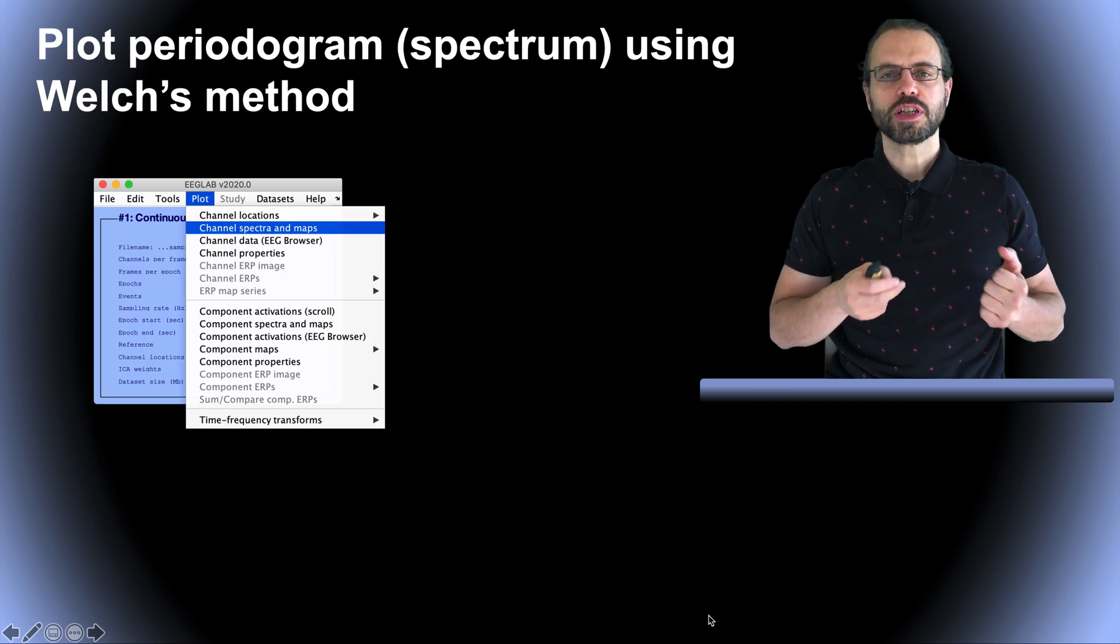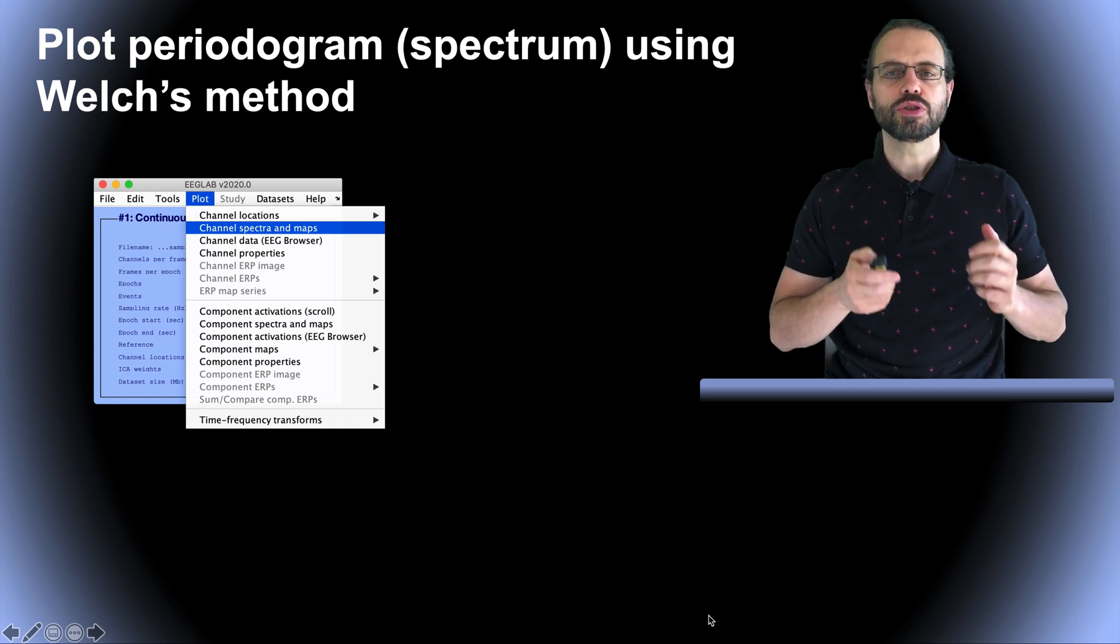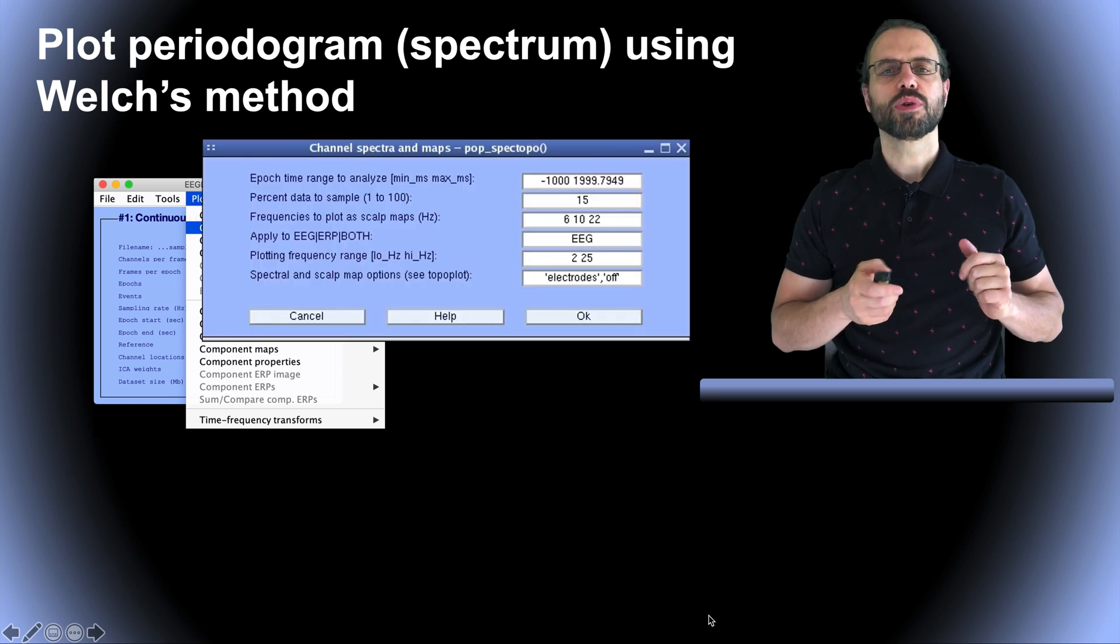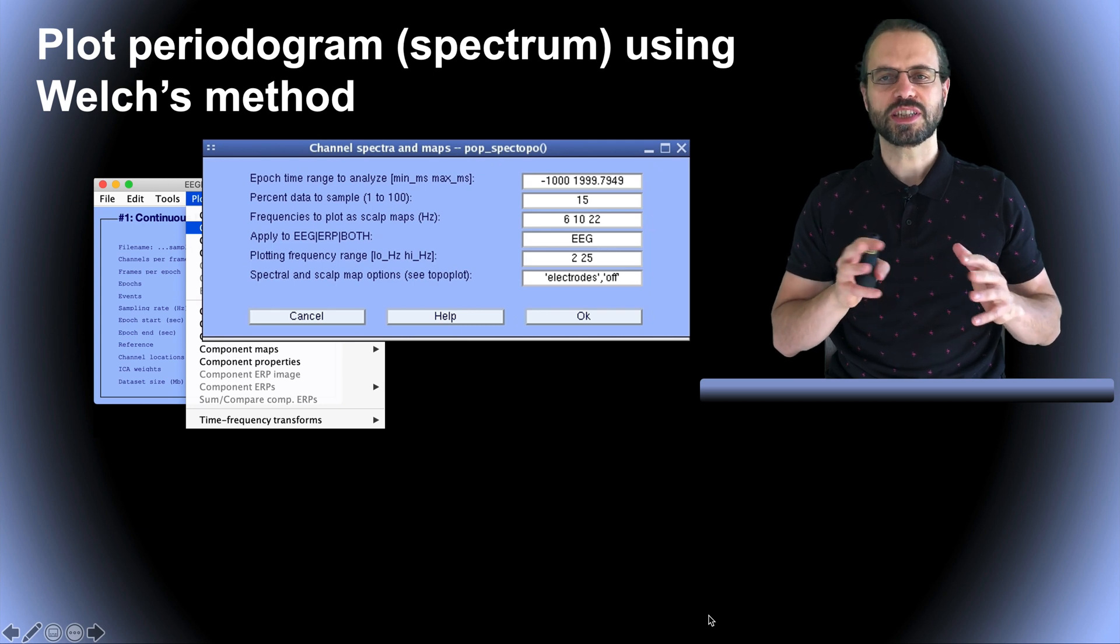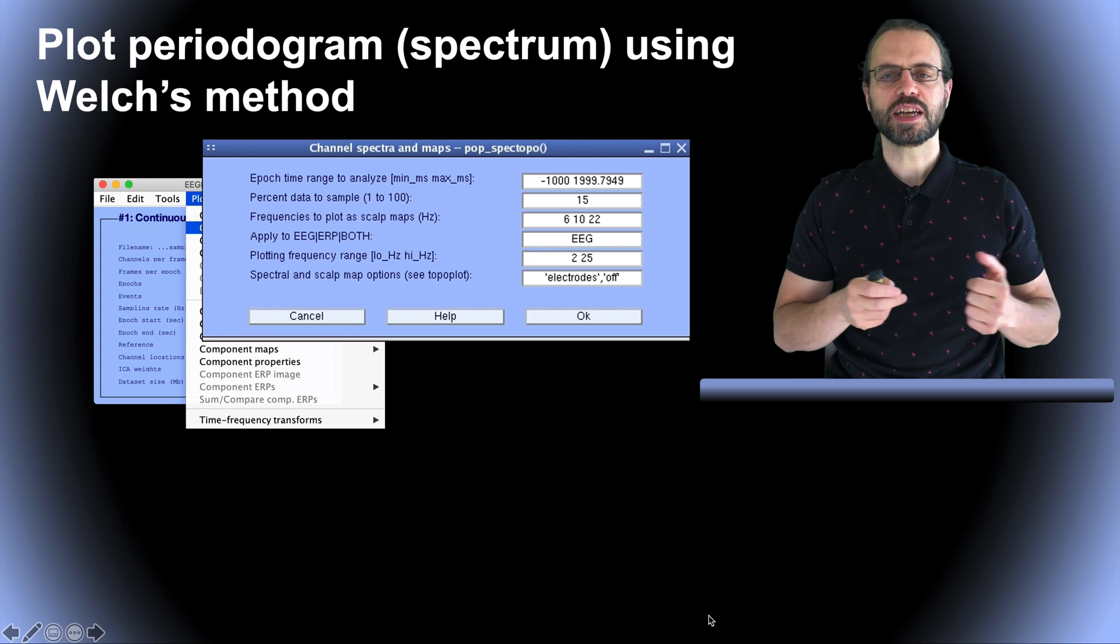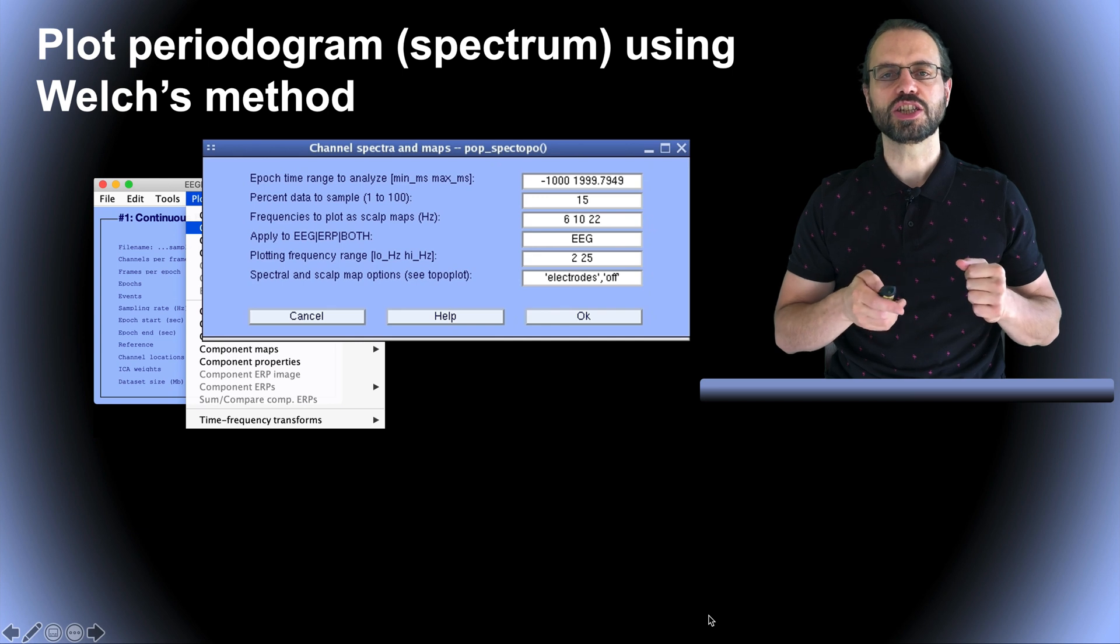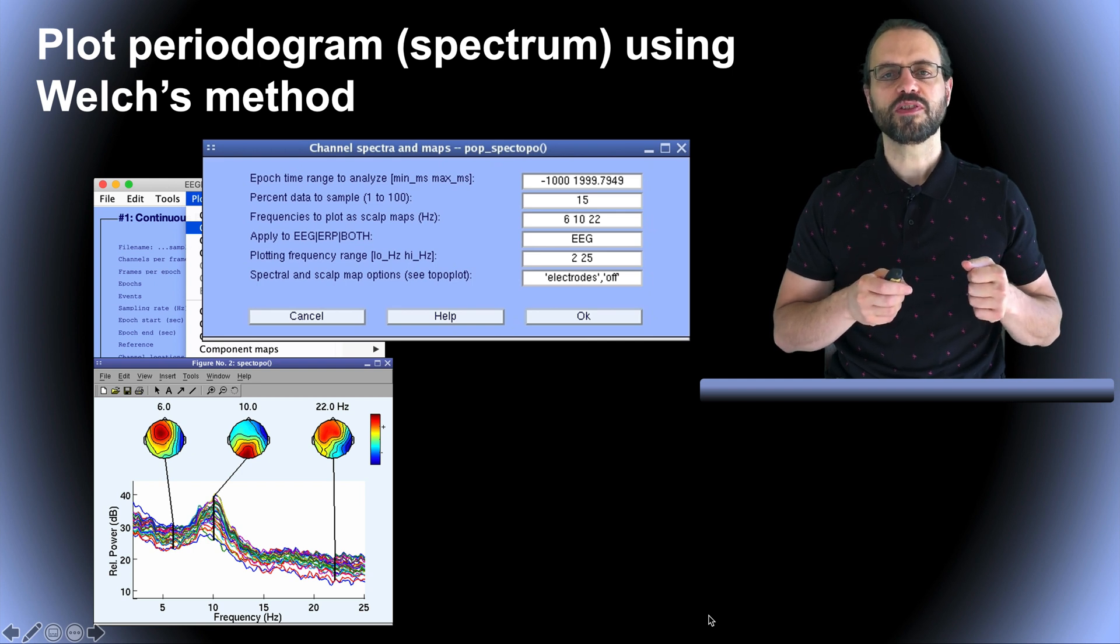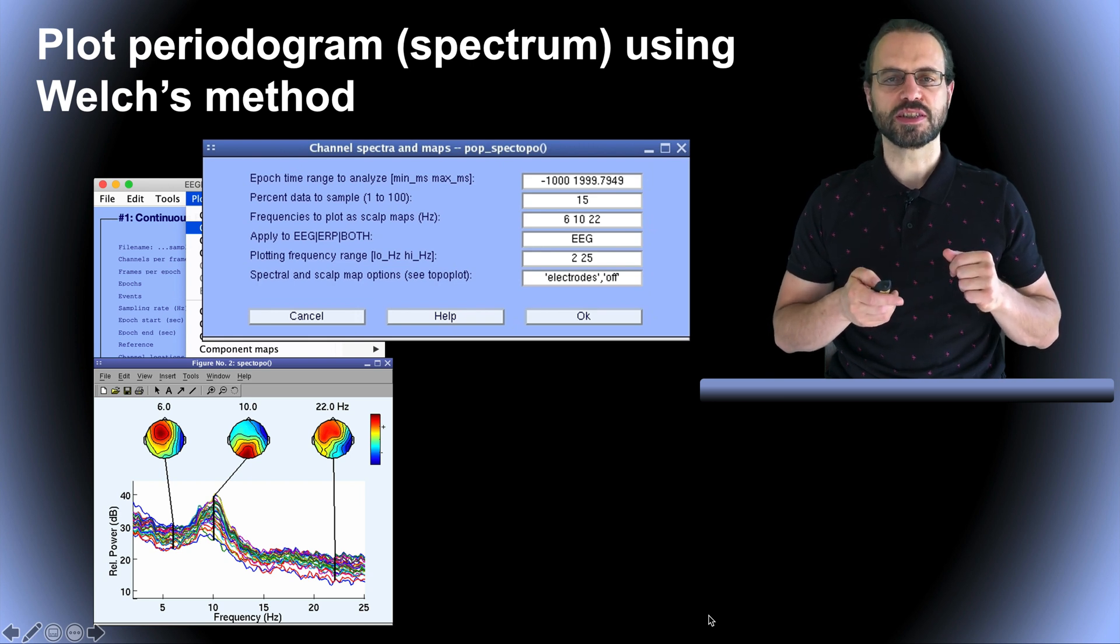Here we assume you've loaded a continuous EEGLAB dataset and that it contains channel locations. Then you would go to the Plot menu and select Channel, Spectra and Map. Once you do that, a window pops up asking for more parameters. Most of these parameters are self-explanatory. You can get more details about these parameters if you select the Help menu on this interface or you can also look at the EEGLAB tutorial. You simply press OK and this type of plot is the one you would obtain with each trace representing one electrode and scalp topographies plotted at the selected frequencies.